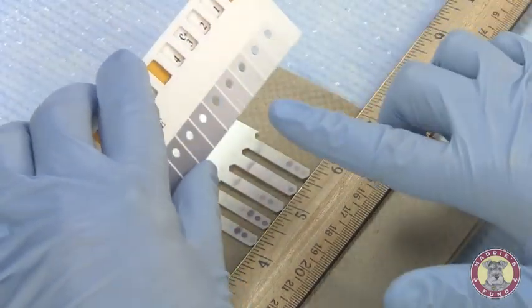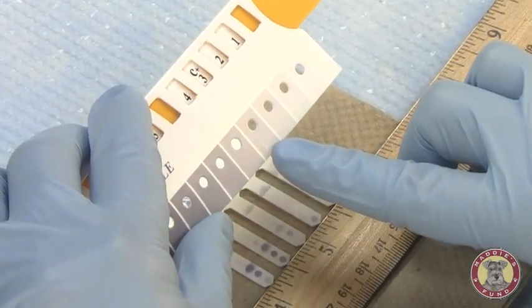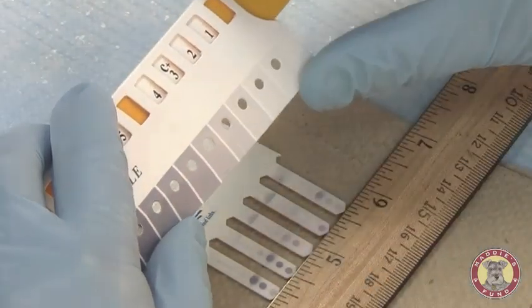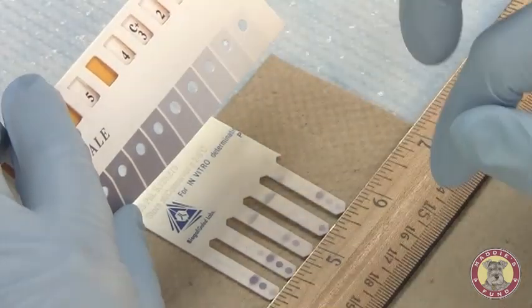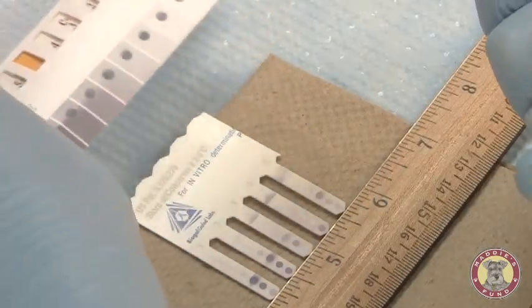I now have set my positive control. The positive control is valued at 3. I will now compare all of my samples to that positive control reference color and gauge the color development and what results are positive and the value.